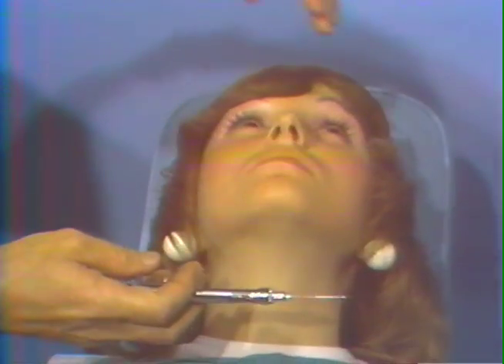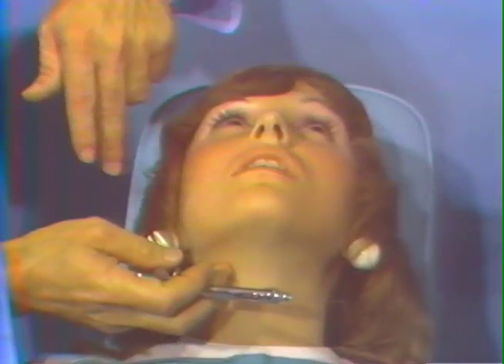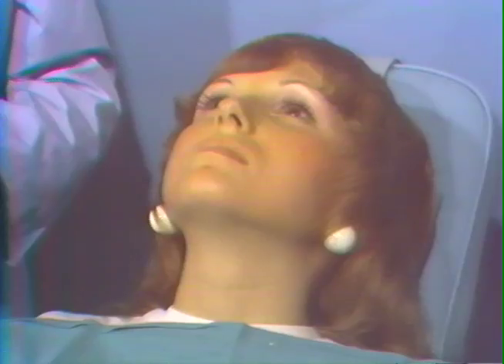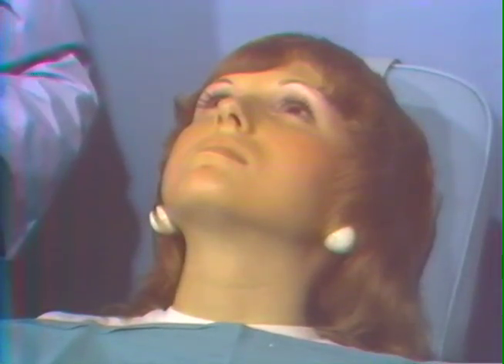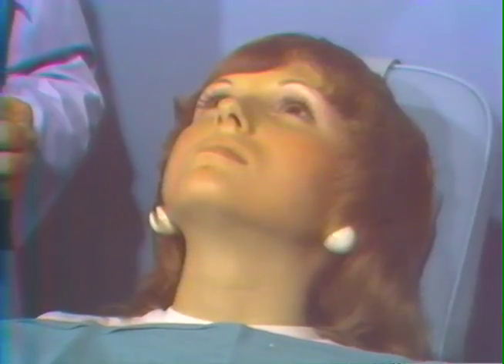now tip your head back once again. There are three landmarks to encounter: the greater palatine foramens on the right and left sides, and the incisive canal behind the upper central incisors. For the injection of the upper right greater palatine nerve, proceed in this manner.